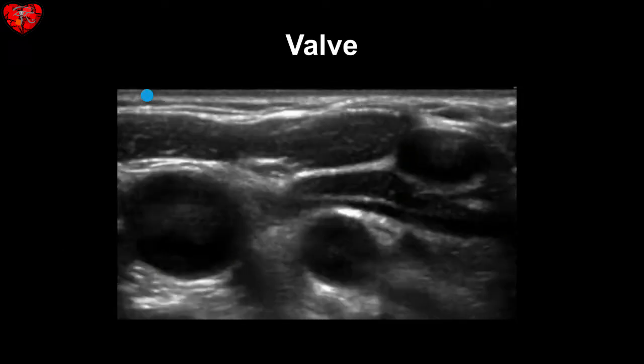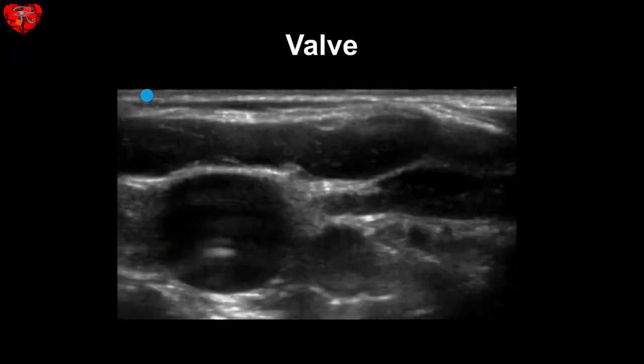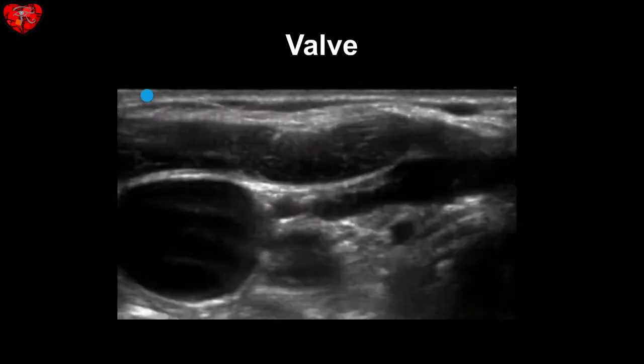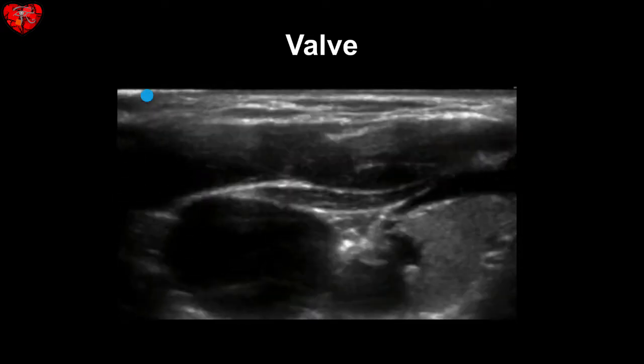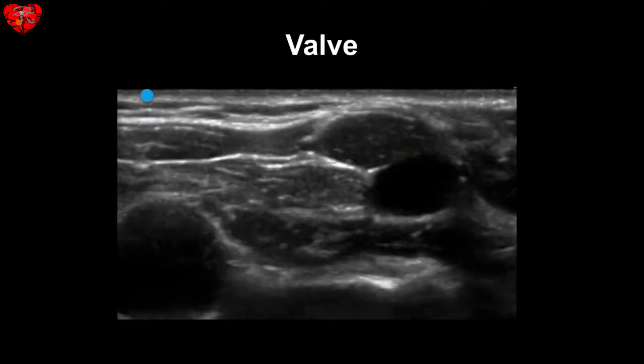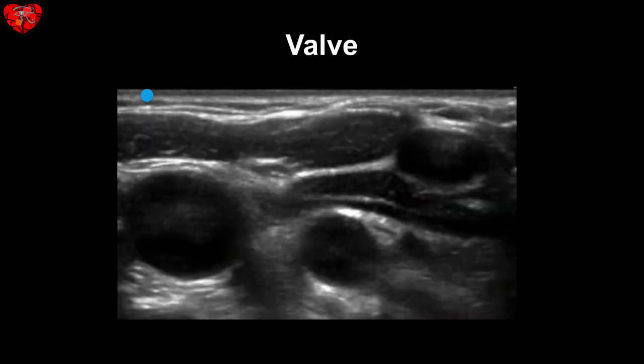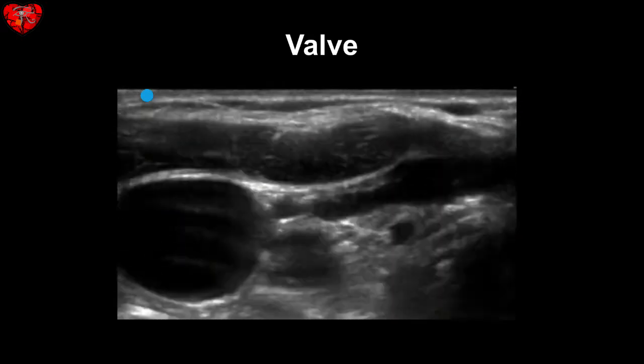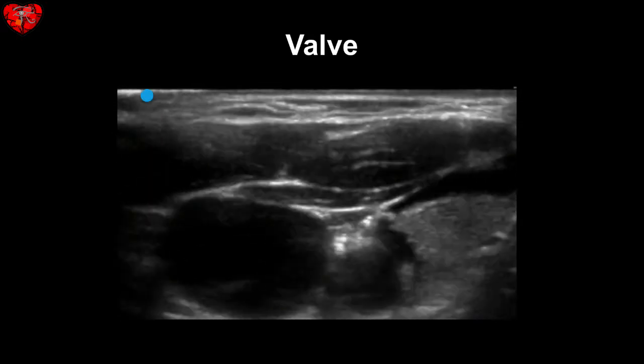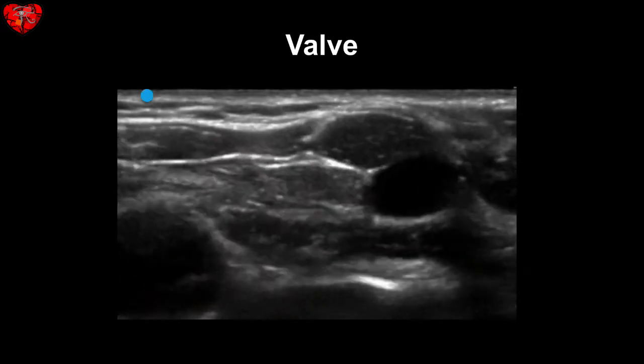Sometimes you can see valves within the vein, and that's what we're seeing right here. Take a look — you see something flopping within that vessel. That is a valve within the vein.